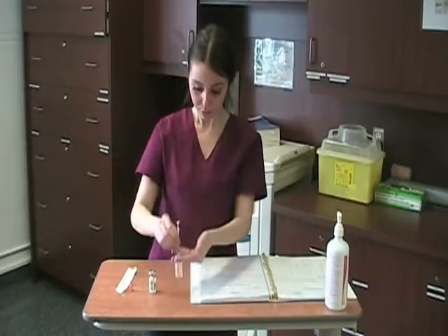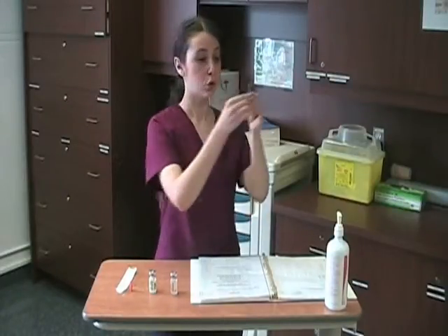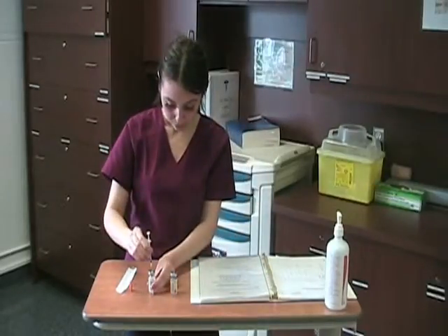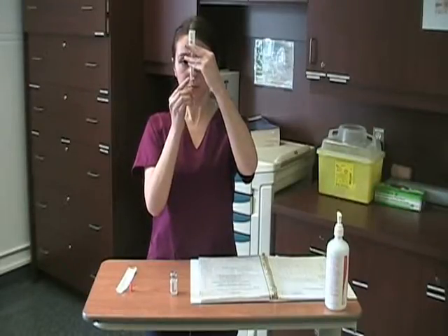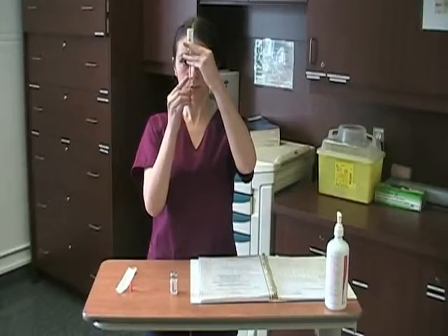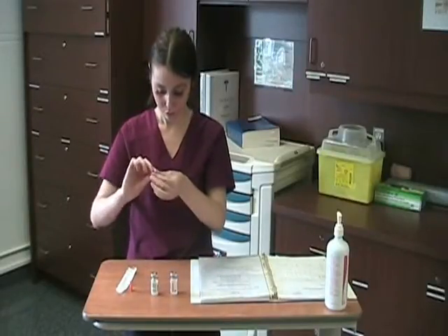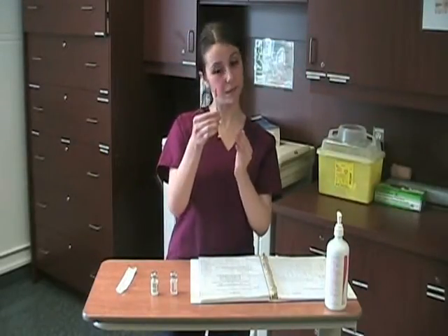We're going to draw four units of Humulin R, always making sure that there are no air bubbles. It's very important to show the amount of units drawn to your teacher. My teacher checked and this is fine. Now we're going to draw 30 units of the slow acting Humulin N, and again show the teacher to confirm it's the right amount.